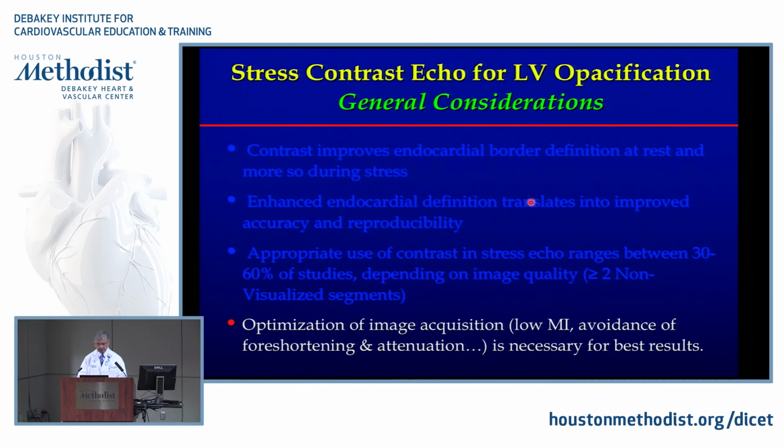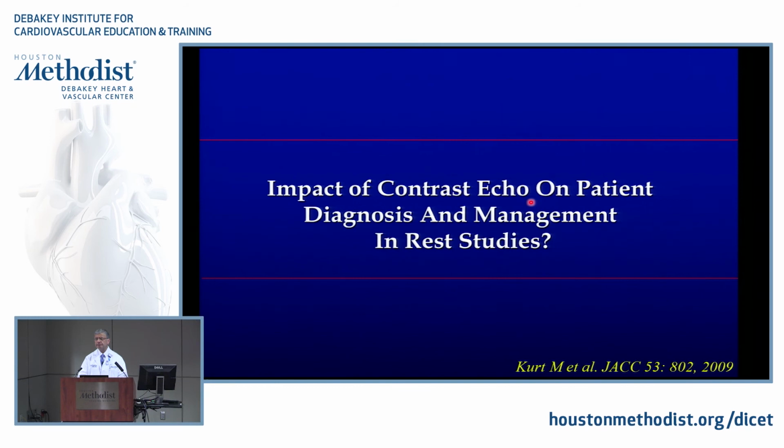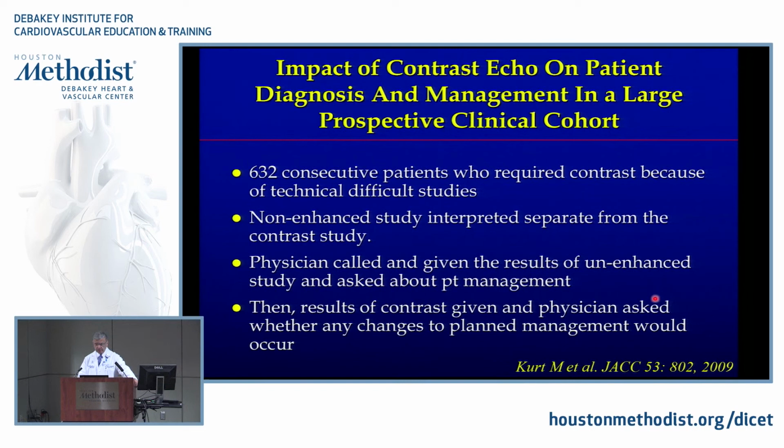And last is, you know, what's the impact on clinical management, if you will. And that's a study that Mohammed Kurt, when he was here visiting from Turkey, did. And this is, what, 7 years ago almost, 8 years ago. Probably among the most cited outcome measures from contrast. 632 individuals consecutive in this institution who required contrast because of technical difficulty.